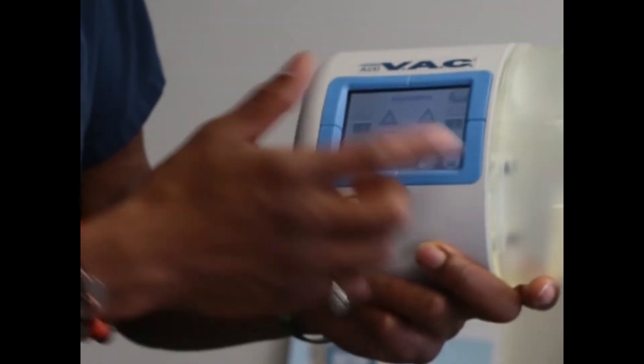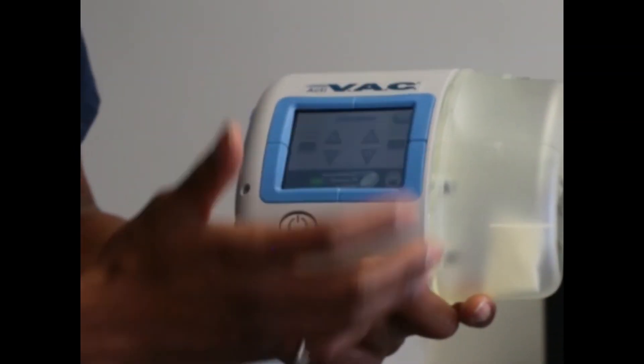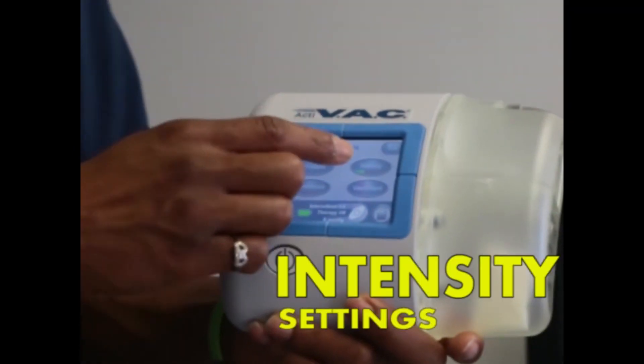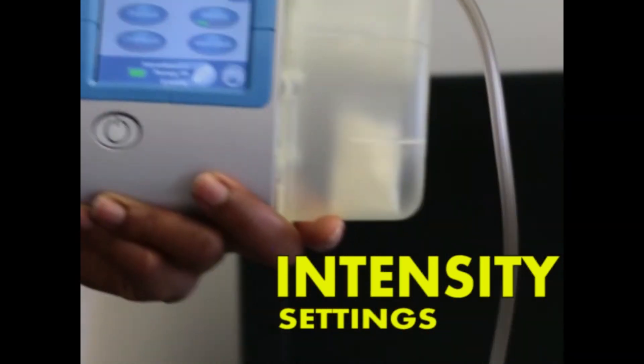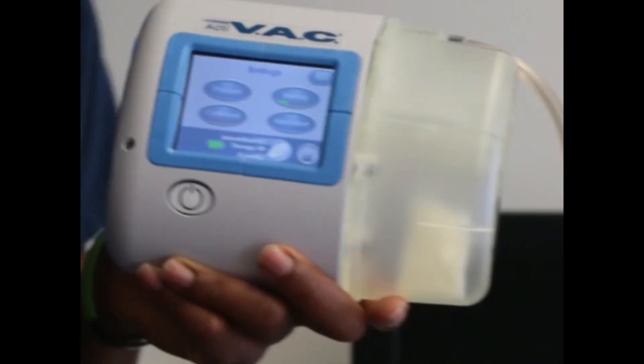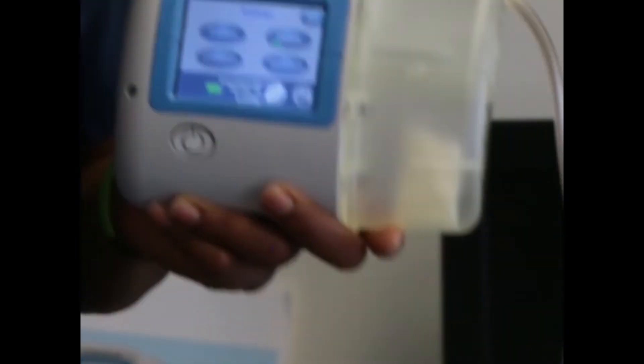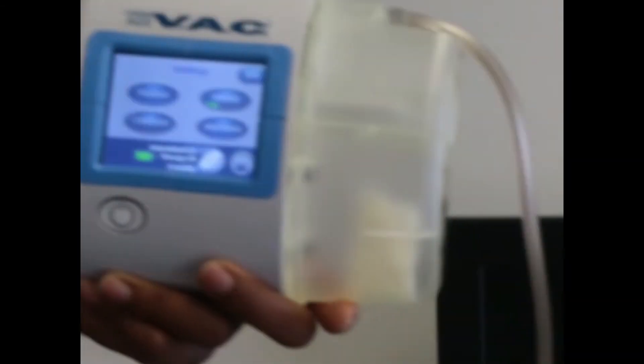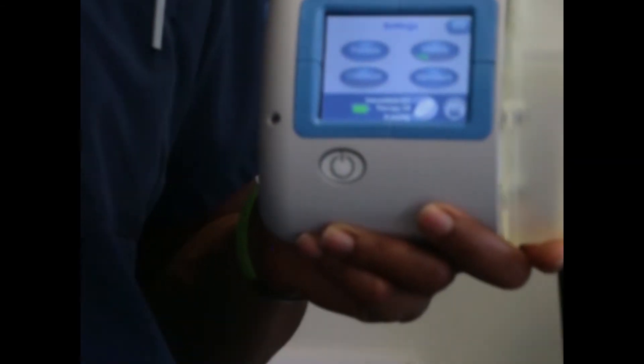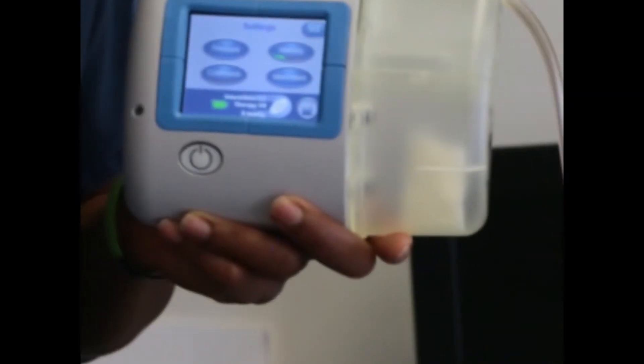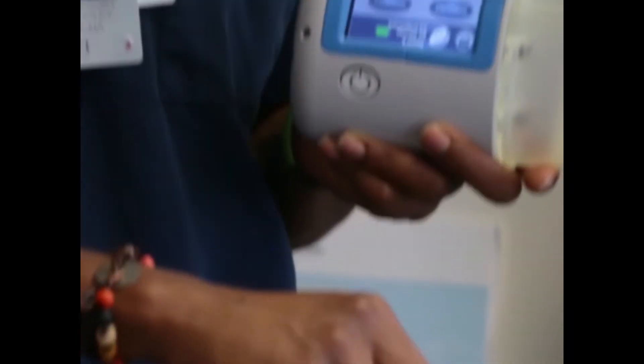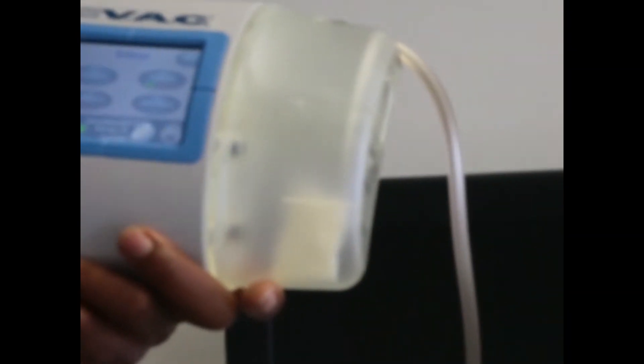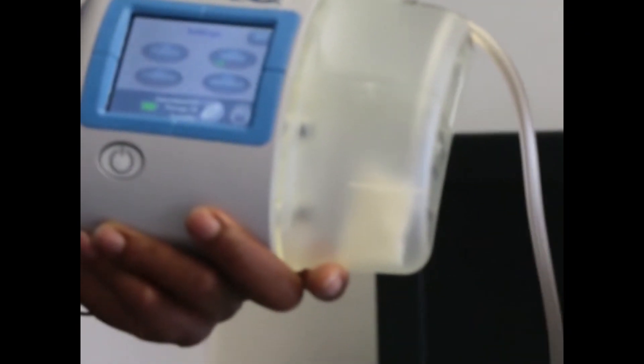So again, you can adjust how long it's on for and how long it's off, the intermittent time. And then the intensity. Intensity only means the drawdown of the dressing. It doesn't mean how hard it's sucking or anything like that. So again, because pain is subjective, it's what a person feels, you can adjust the intensity to drawing down slow at a medium speed or fast. Oh, I didn't know if you had that. Yeah, that's all that is. Is that prescribed by the physician, the intensity? I would always just say, get ready. Get ready, here we go.